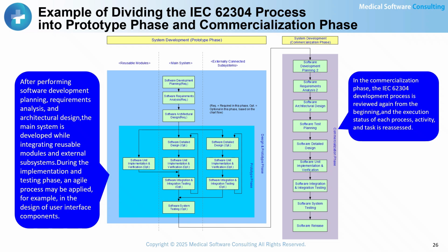It is also critical to ensure that risk control measures implemented in software are not invalidated by software changes. Of course, testing, verification, and validation during the commercialization phase will confirm this. But already in the planning stage, the development process should be designed in a way that minimizes the likelihood of such problems.